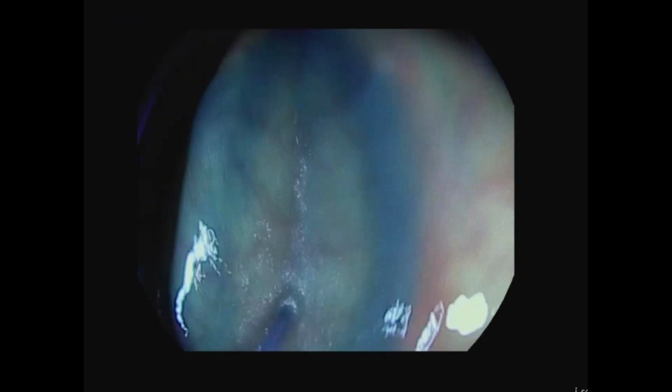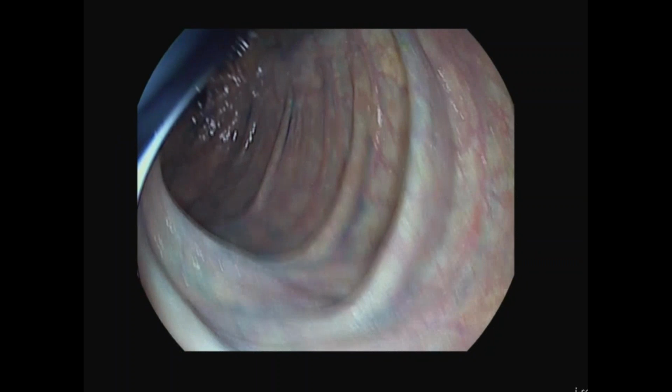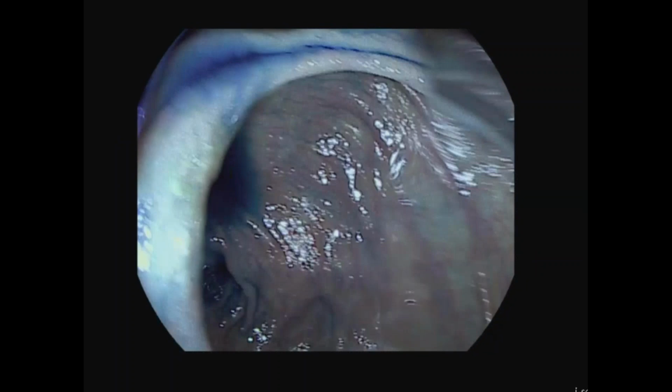So you can see here with the pump jet, with the clockwise circumferential movement, I try to paint uniformly my mucosa, and then I go in again, suction, and analyze 20 to 30 centimeters of my segment.